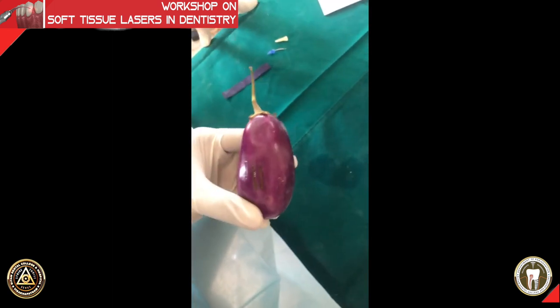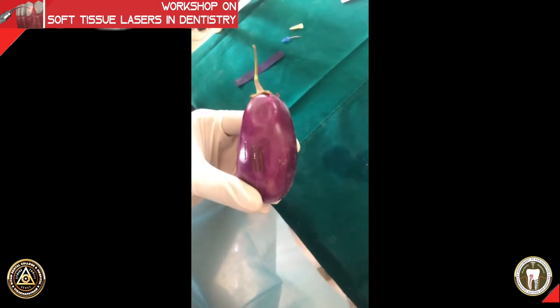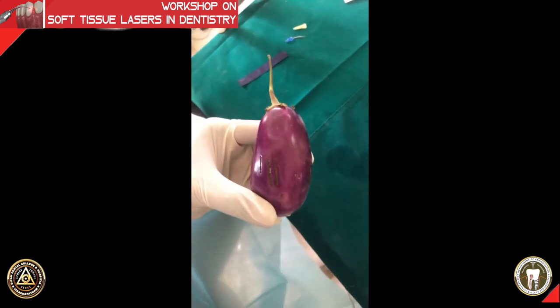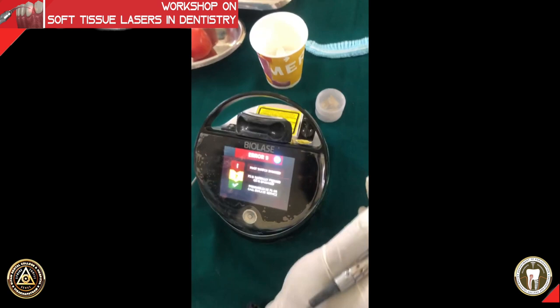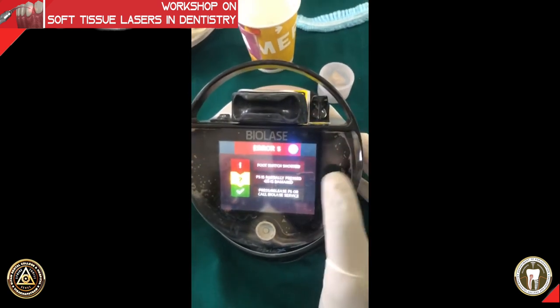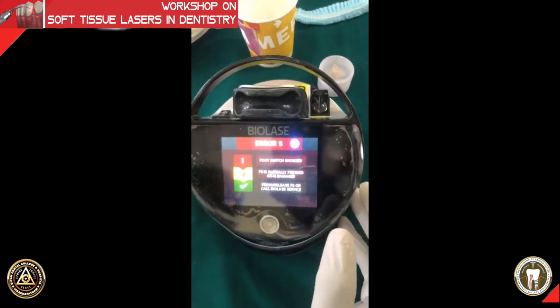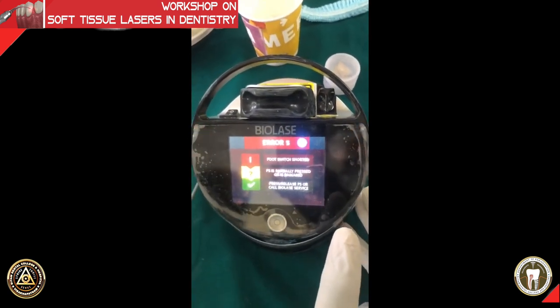There is some error in the machine — this is how an error will be shown. Whenever you have a problem with your machine it will display an error sign and you have to figure it out. There is some pairing issue which we will sort out now.